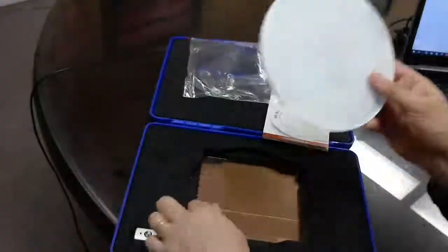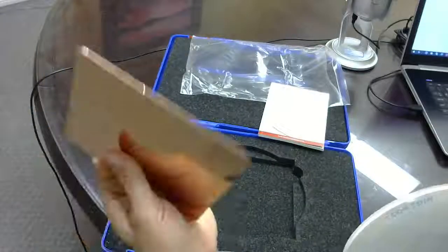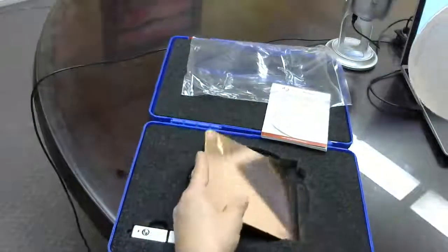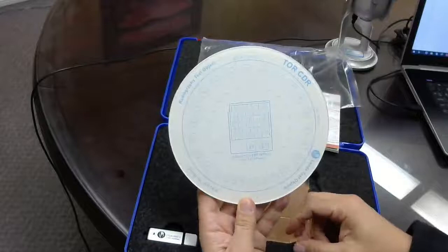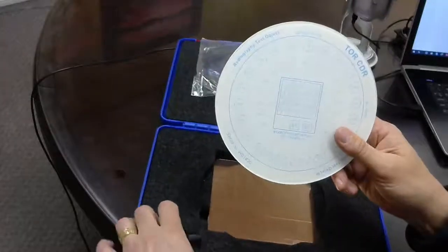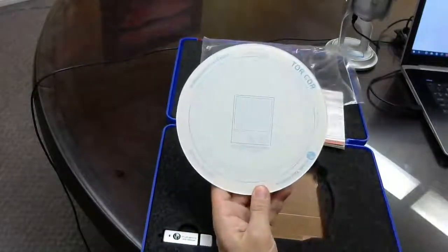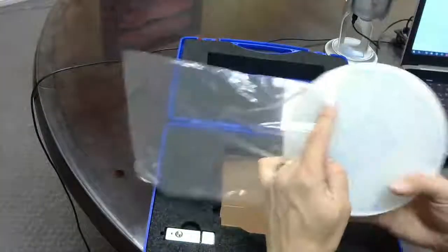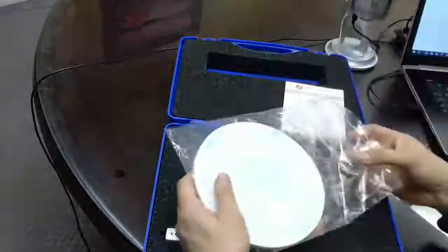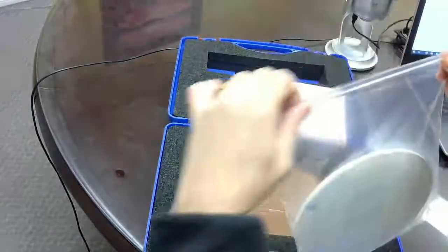It also comes with a one millimeter copper plate for attenuation, and that's all in the case here. I'll have a copy of the user manual on our web page at cspmedical.com. This is another quick two-minute unboxing to show you the latest test objects and imaging QA products we have to offer.